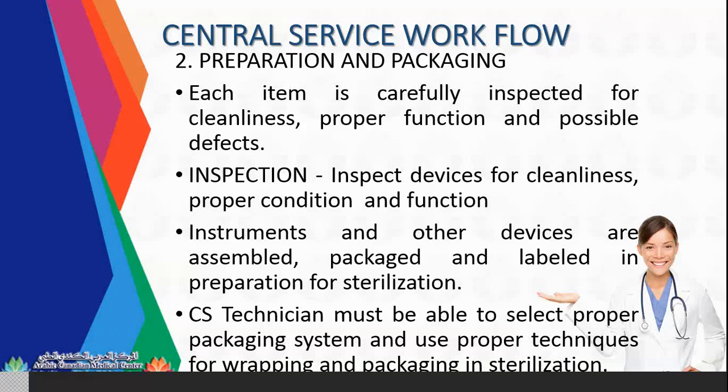Assembled, guys, because I forgot to mention it. Once you soak instruments in the ultrasonic machine, you need to disassemble the instruments. Once you place the instruments in preparation and packaging, you need to assemble them again for testing. And then you need to disassemble them again once you sterilize and pouch them. Pouch and sterilize it.